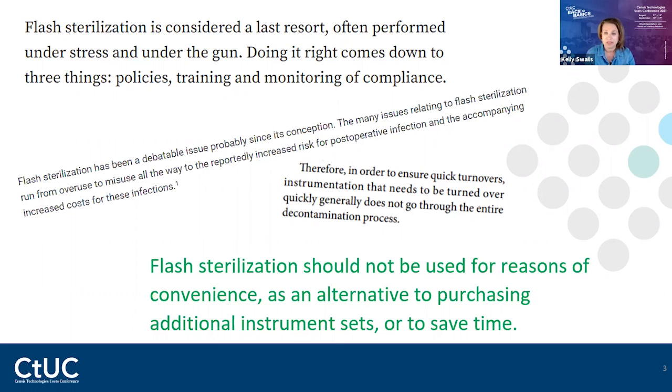So those days are done, no more open for sure. We were doing that because we didn't have enough instruments. So with specific containers geared for IUSS, that has helped. So I don't think that's so much the issue, it's the cleaning.